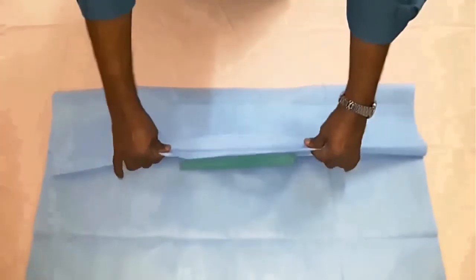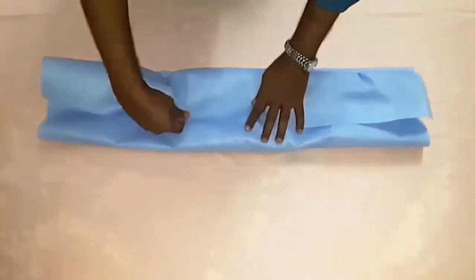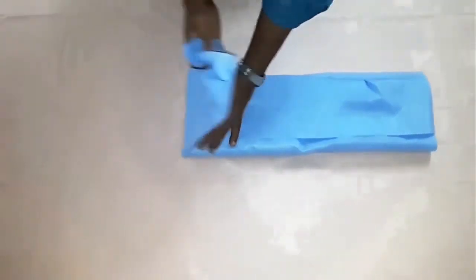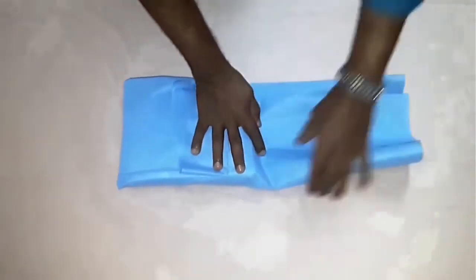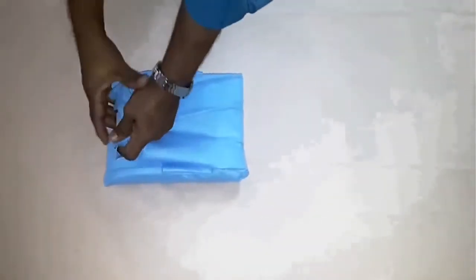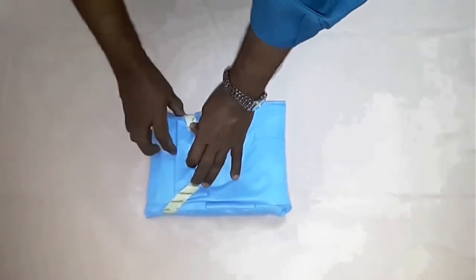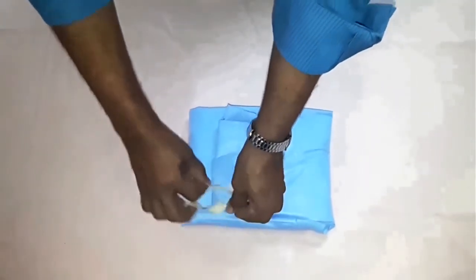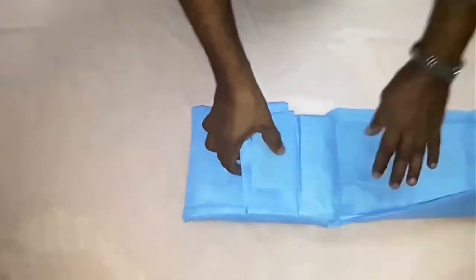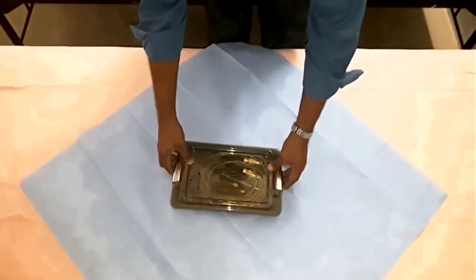This is the parcel way of packing, where whenever you fold, you give a flap outside. So, see, that's the principle of packing. This is called the parcel way of packing. This is for the staff to start the theater. So when you open, you're not going to touch the inner surface of the pack at all. So you always have a flap to hold to bring it out. This is called the parcel method of packing.